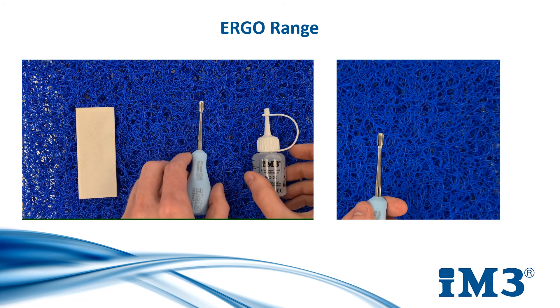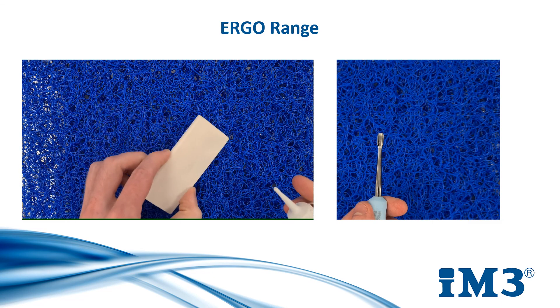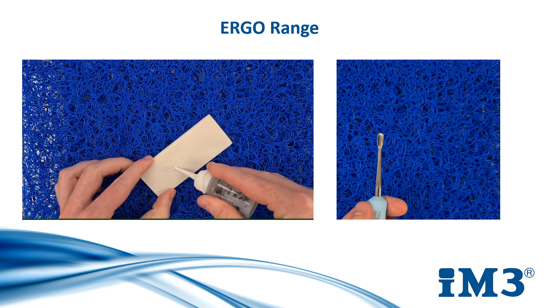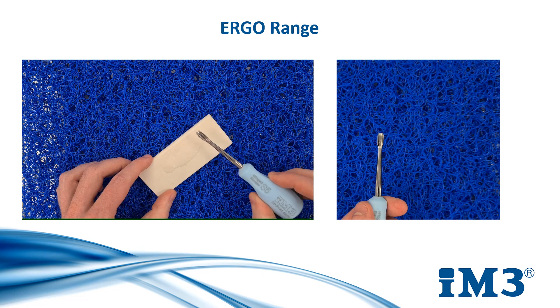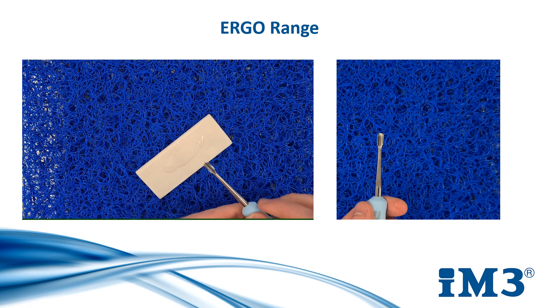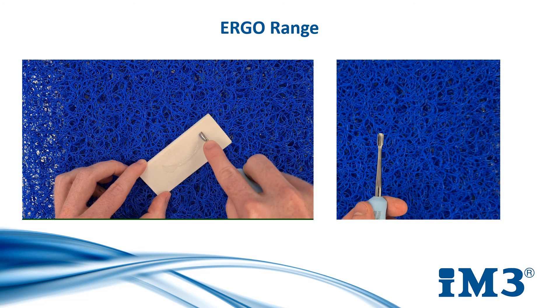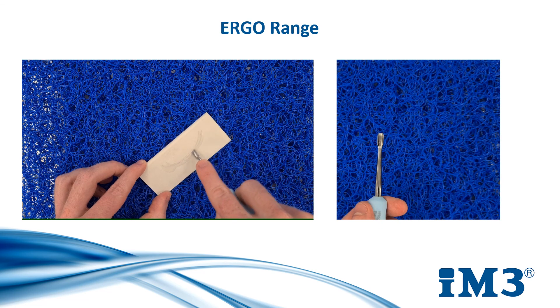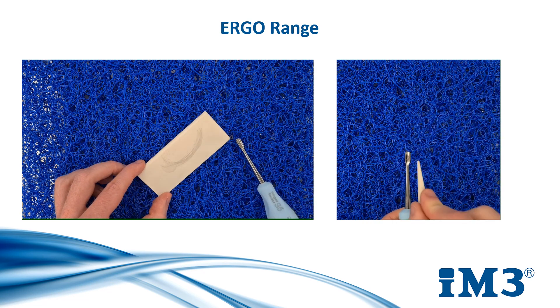To sharpen the ergo range of elevators and luxators, draw a smiley face on the sharpening stone with MD-30 handpiece oil. You sharpen the beveled end of the instrument at the back of the blade. Angle the instrument at 45 degrees and follow the curvature of the smiley face, evenly sharpening the entire blade edge. For winged elevators, work the conical stone between the wings in an upwards motion. This is a tapered sharpening stone to cater for all size elevator tips.